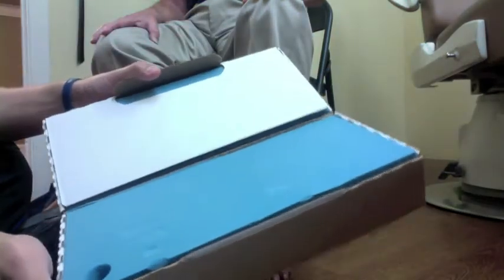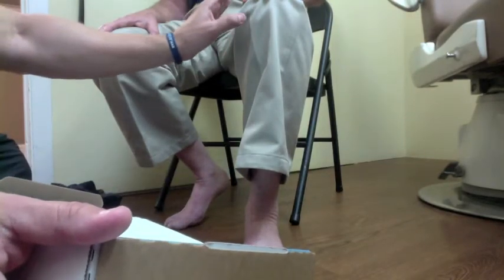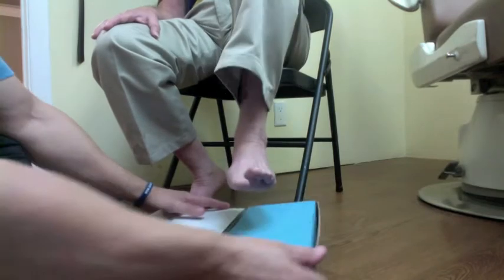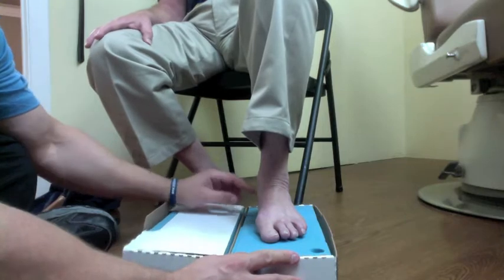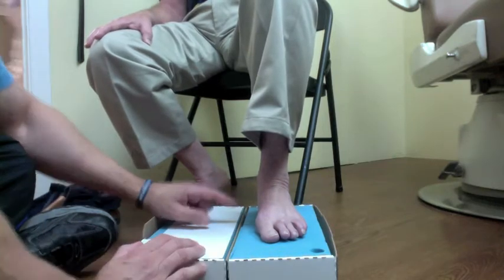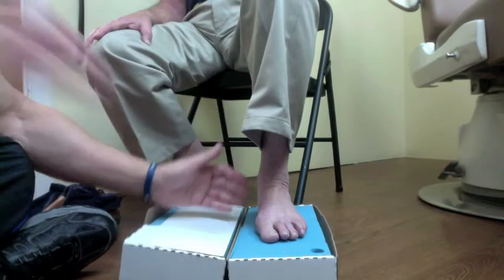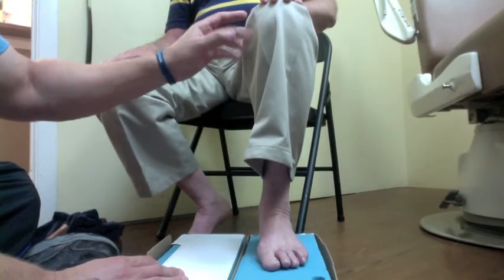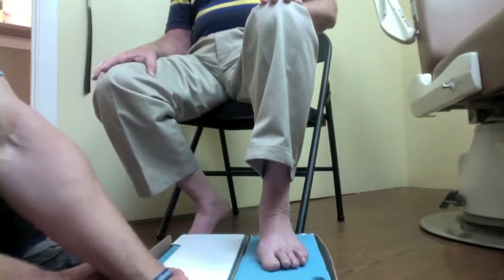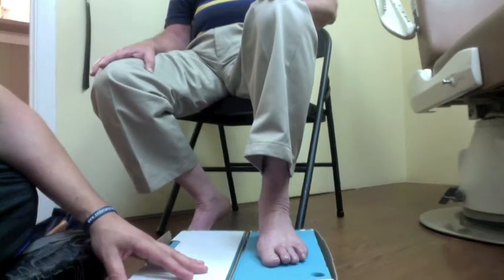You're going to take the foam box, fold it underneath, put it down, and then raise his leg straight up. Slide the box underneath, go ahead and put your foot on but don't press in. In this position, you have to check from the side to make sure it's still at 90 degrees at the knee and the ankle. He raised his knee just a tiny bit because the foam box is raising it up, but in general you want it as straight as possible. Double-check that position.